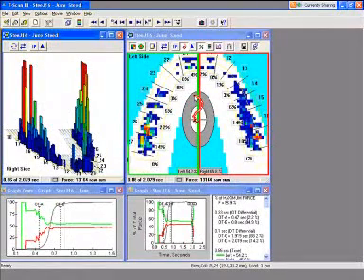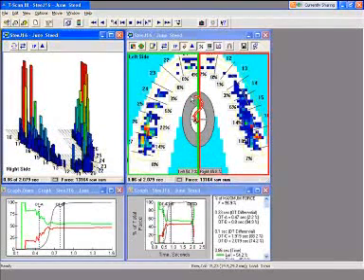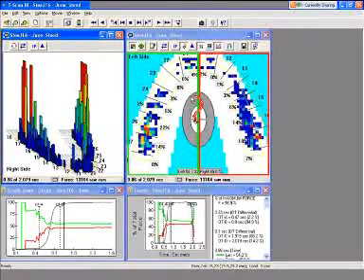Now, there is a dentist that I'd like to give credit to, Dr. Robert Supple, and he's in Albuquerque, New Mexico, and he has really been using TScan in dental hygiene for many, many years. In fact, I think he has 5 handles, and part of his exam is, yes, mirror, explorer, perio probe, and a TScan handle.